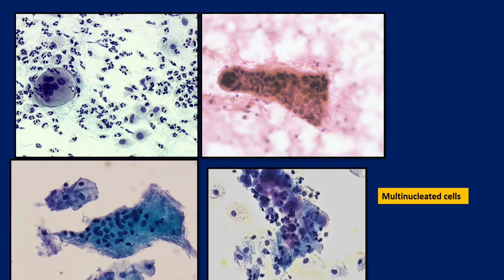This is a multinucleated histiocyte. This is something which you saw in the previous presentation. This is a multinucleated syncytial trophoblast. This one, as I mentioned in the previous, I have some doubts whether it can be called a multinucleated histiocyte or whether there is just changes, reactive changes in the cervical cells. I'm not very sure. And this, of course, are the changes associated with herpes simplex virus.